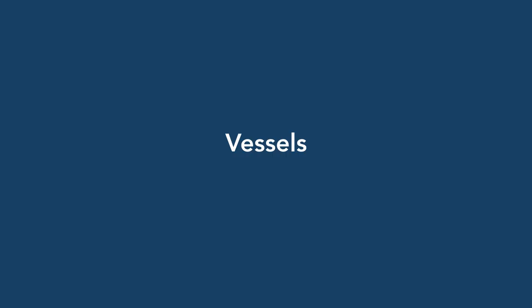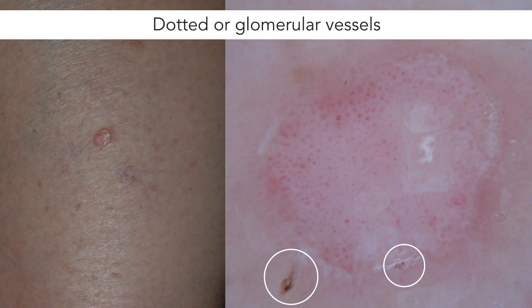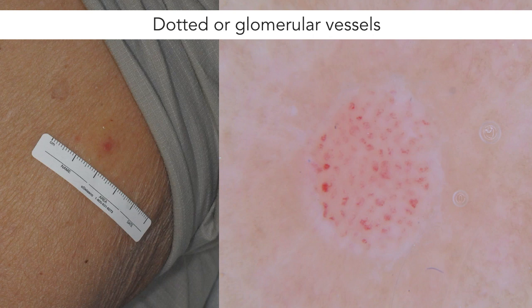Now let's take a look at the vascular structures we can expect to find in porokeratosis. In erythematous lesions such as this one, it's not unusual to find dotted or glomerular vessels, which are commonly regularly distributed as seen here. Here's another case with dotted or glomerular vessels in the central area, with some erosions and blood spots along the keratin rim. Here's one more example in which the vessels can be more easily identified as glomerular.